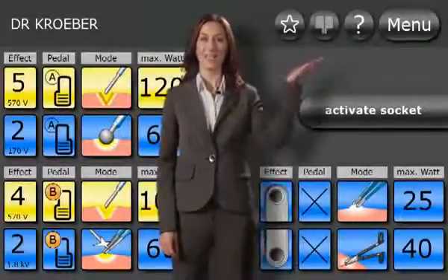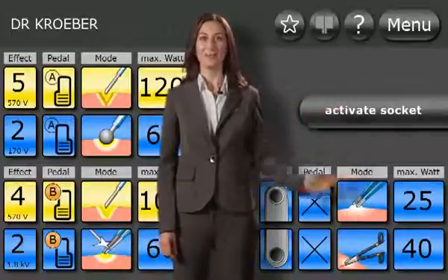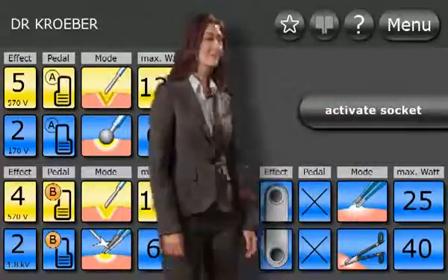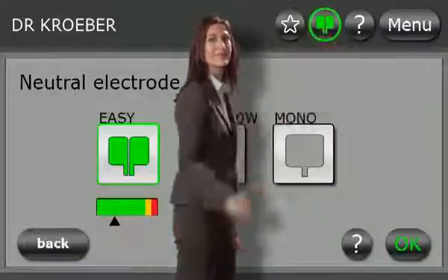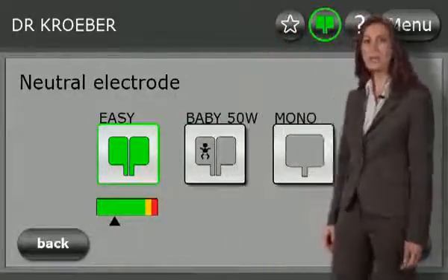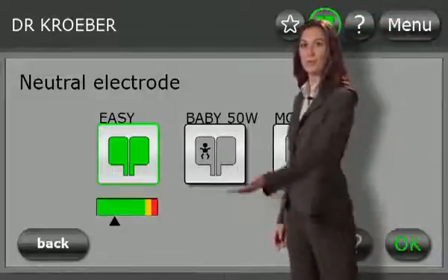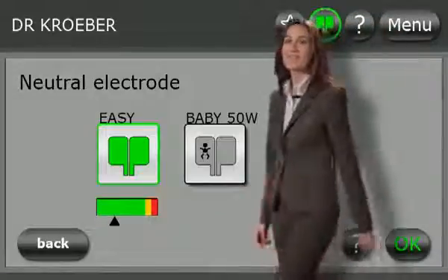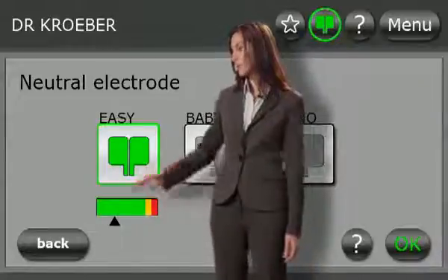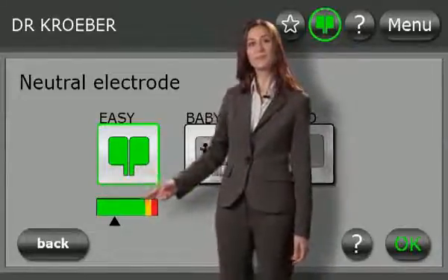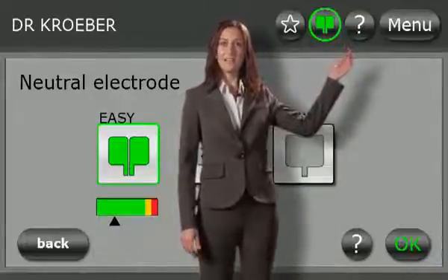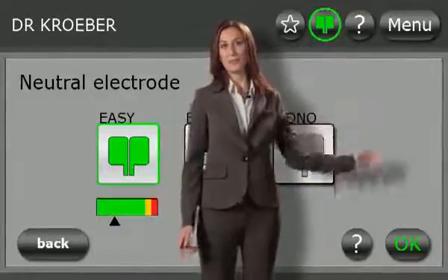Touch the neutral electrode icon to access the menu for selecting various neutral electrode types. Among other options, this offers you a power reduced setting for baby neutral electrodes. The quality of patient contact is shown by this monitoring bar. To obtain further current system information, press the question mark button.